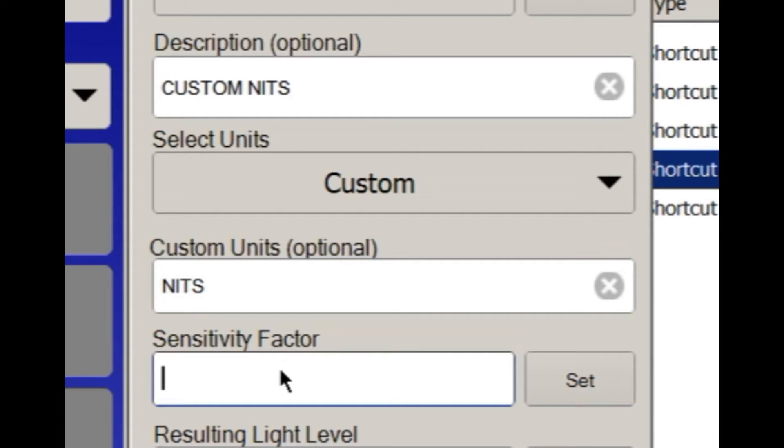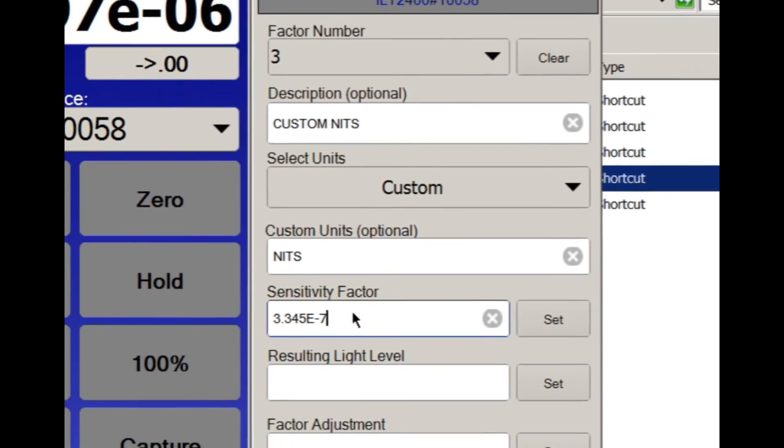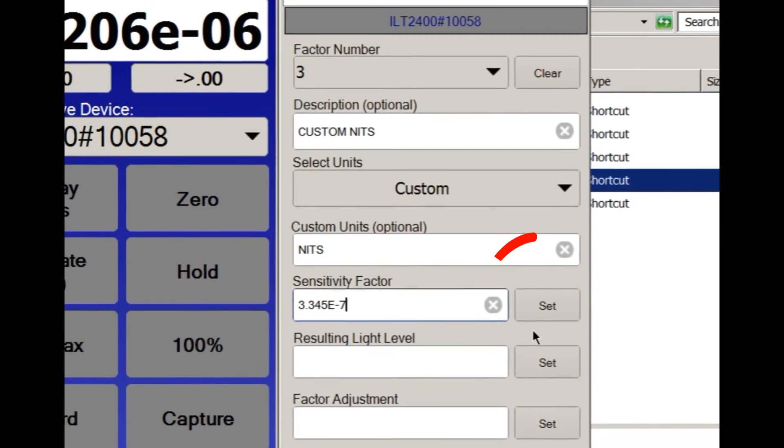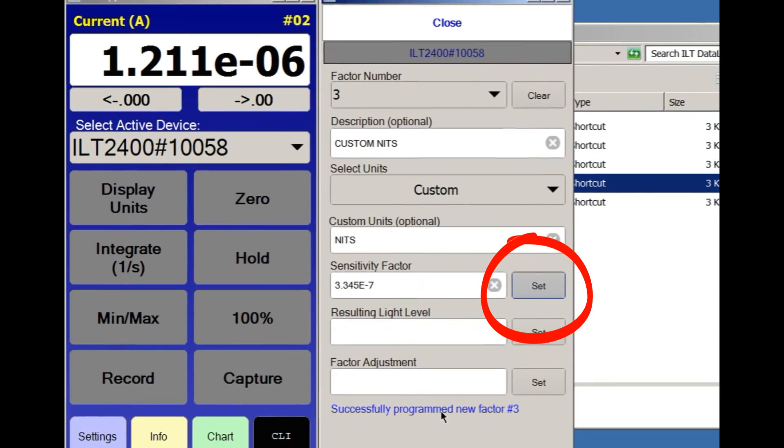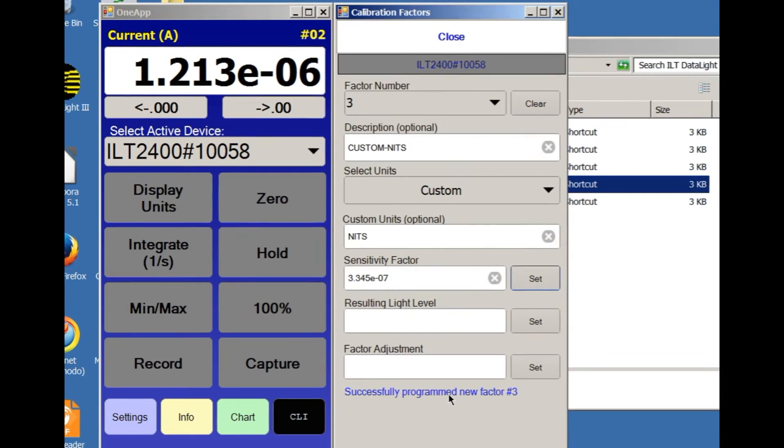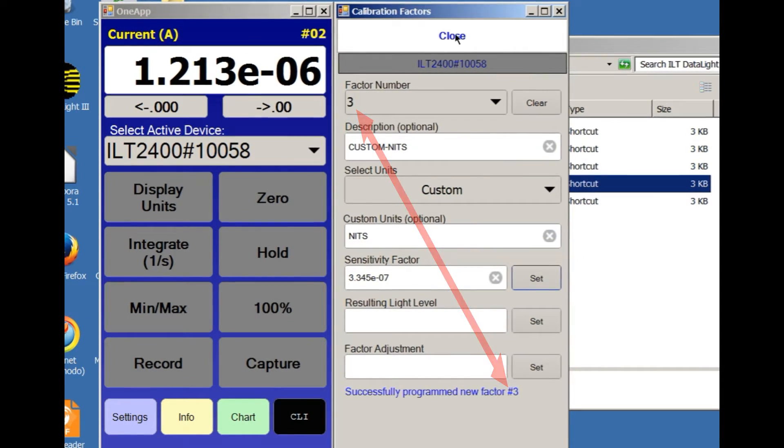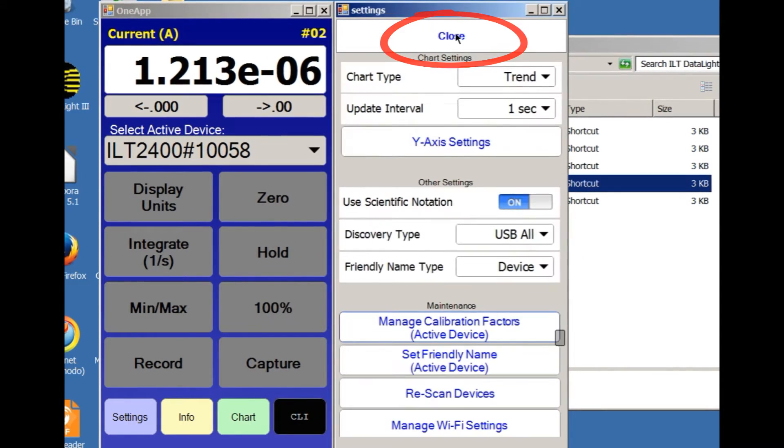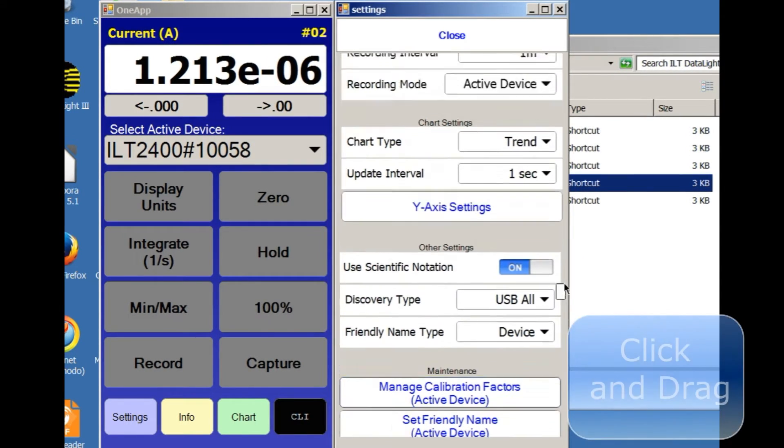Enter the sensitivity factor that will correctly convert the incoming signal to light level readings, and then press the Set button to store the calibration factor. Click Close to exit the Manage Calibration screen.